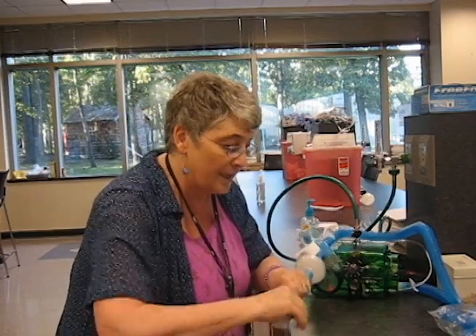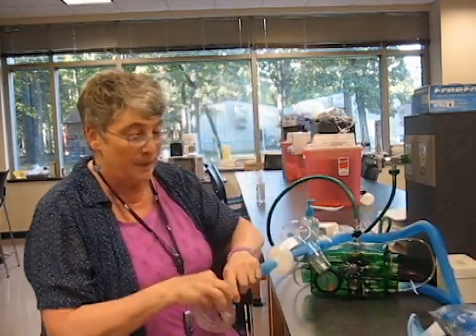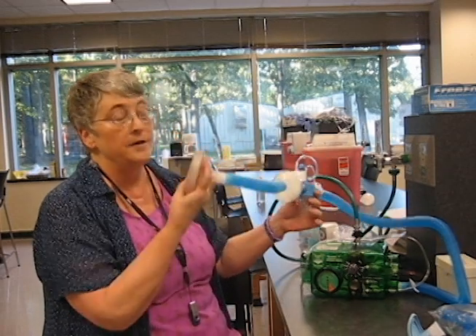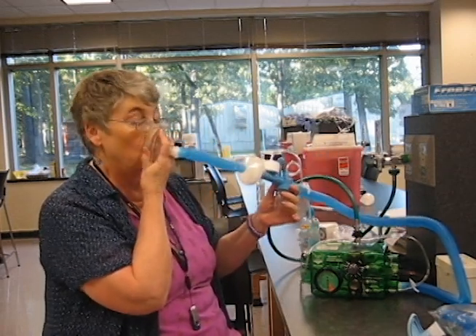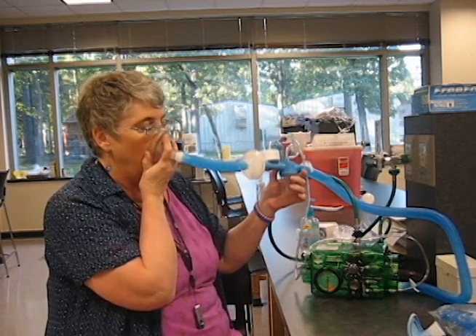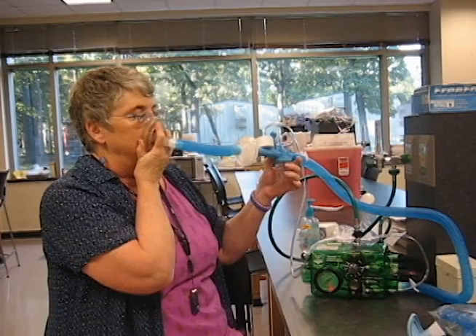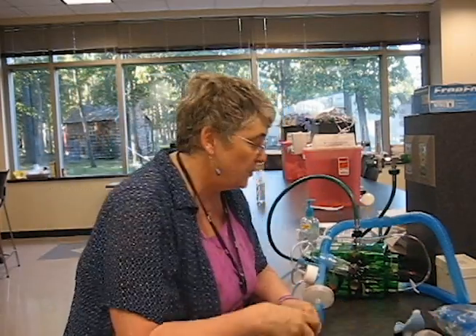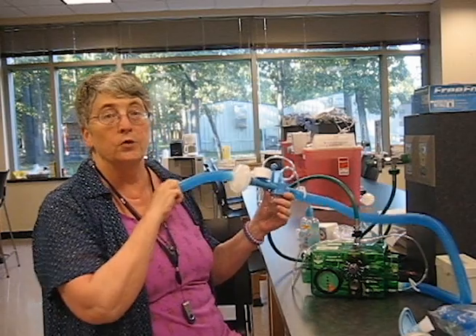And if my patient can't cooperate at all, then we put a mask on him. This mask is a little too small for me. Now, other things a patient can do wrong is that the patient can breathe too fast.